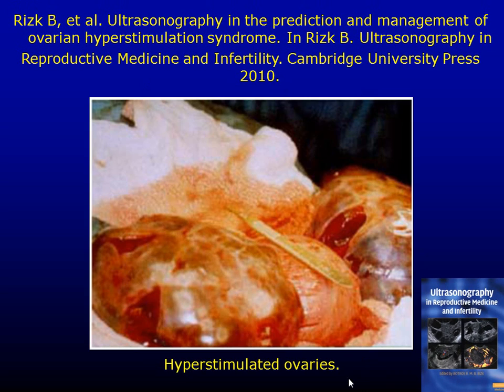And this is from Cairo, Egypt, actually, Professor Sarour, again putting the scalpel here to show you that the scalpel disappears in size in comparison to her ovary. So this was one of the patients referred to him at the Egyptian IVF ET Center with massive corpora lutea. Of course, most difficult to handle. The only option in those patients is not to touch, not to open.